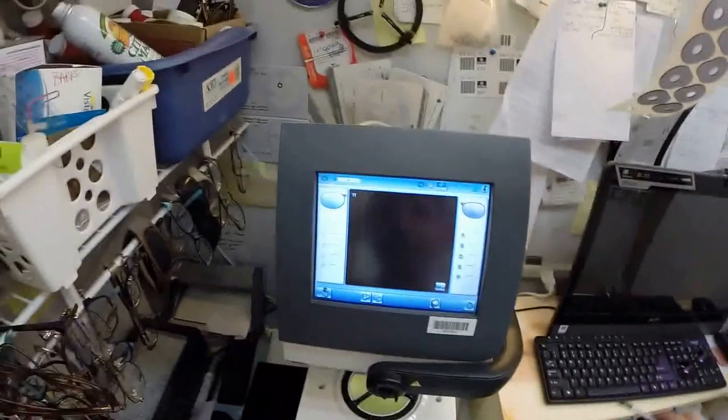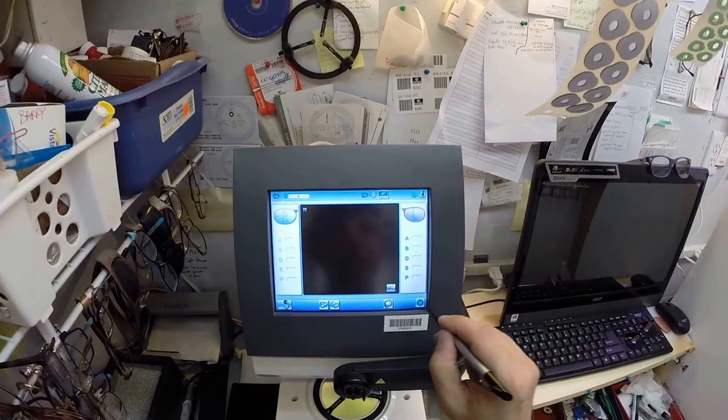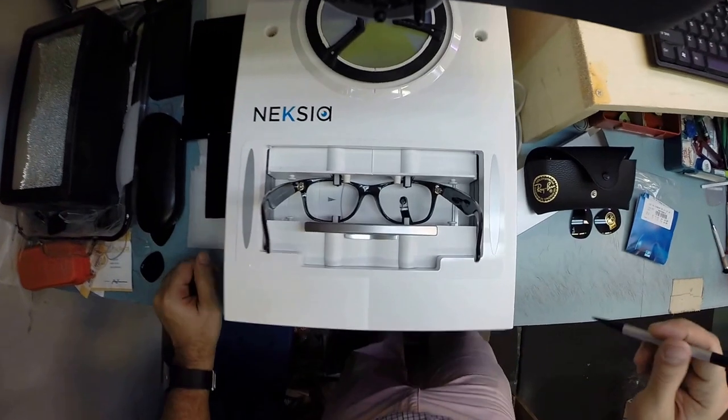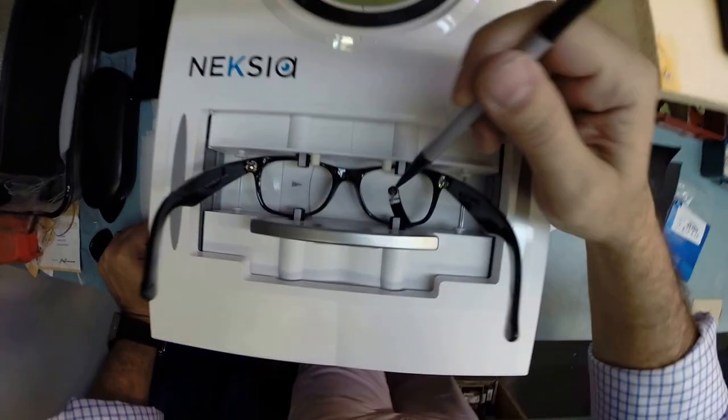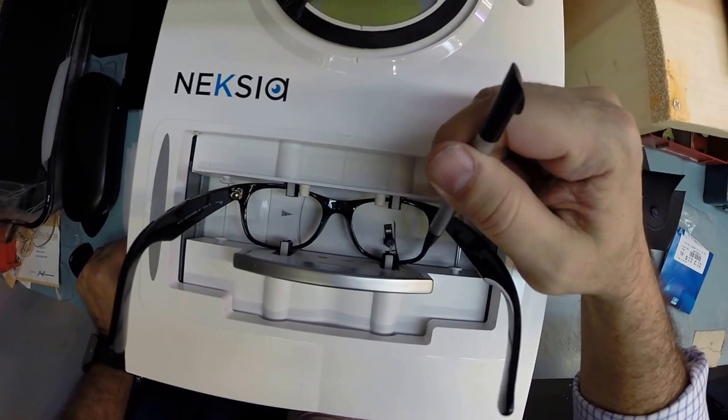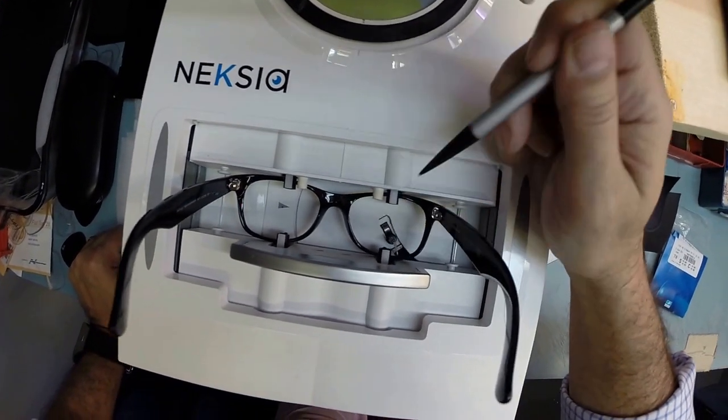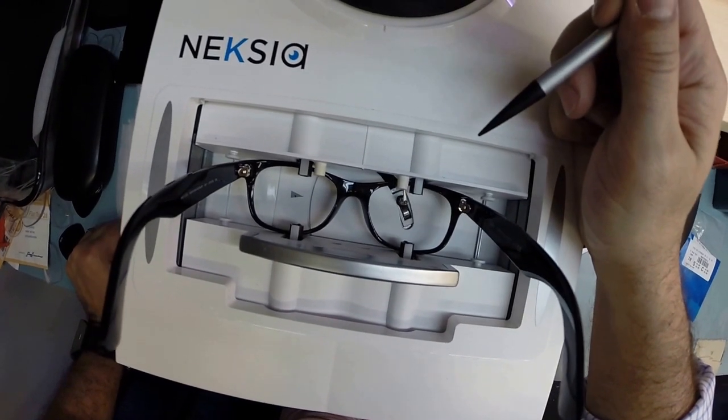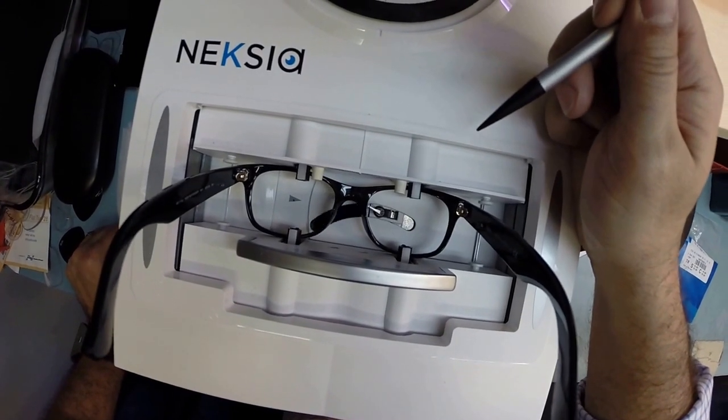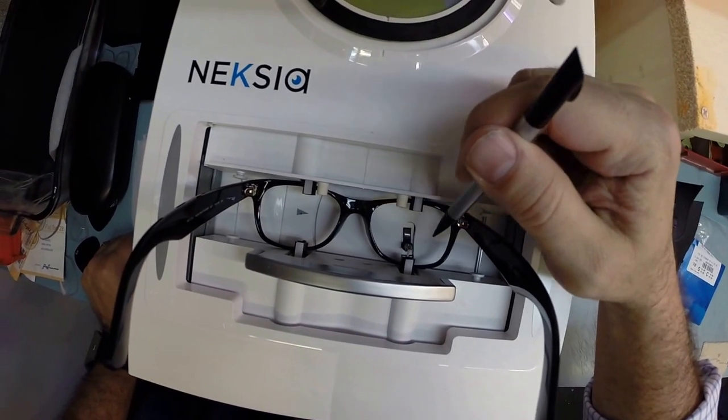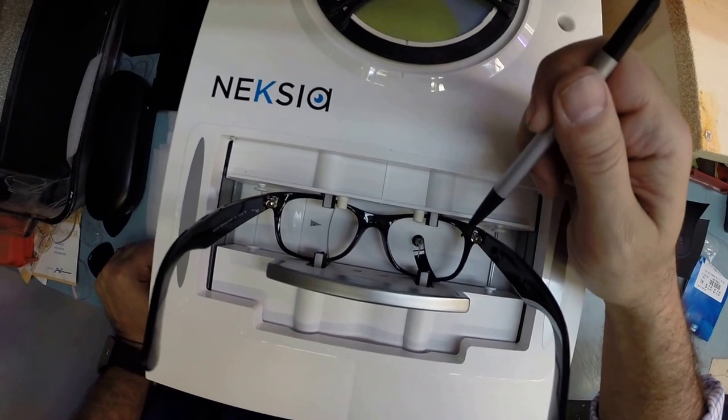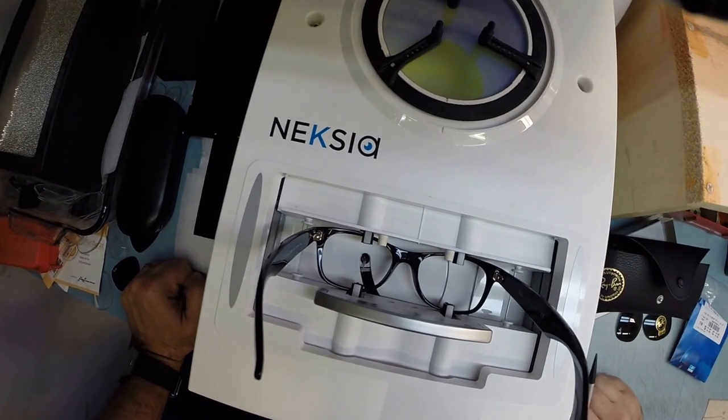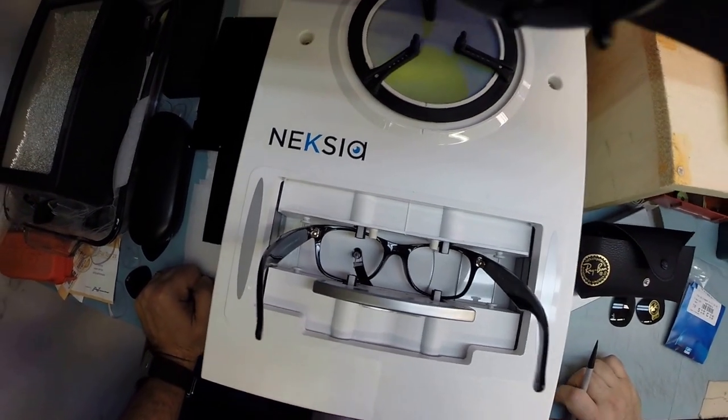I'm going to put it into the tracing element of my edger and hit trace. Now a little stylus is going to pop up and trace the shape of the right lens. This is what everyone wants to know. How does the machine know what shape lens to cut? This is why. That stylus is going to trace the right lens before moving over and tracing the left lens.